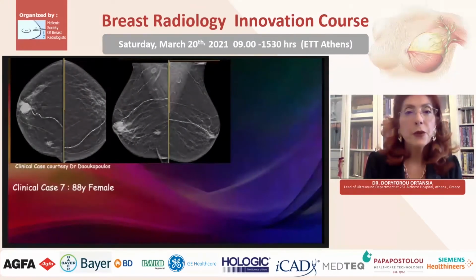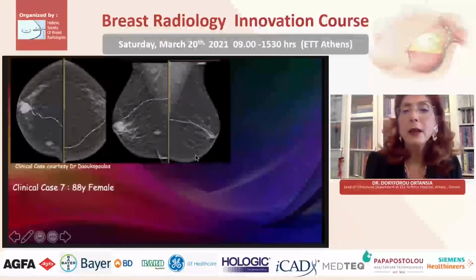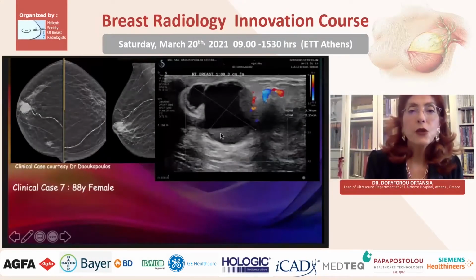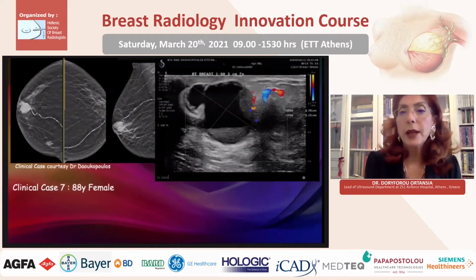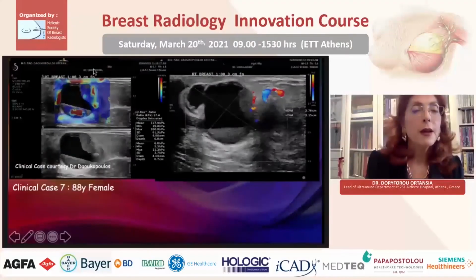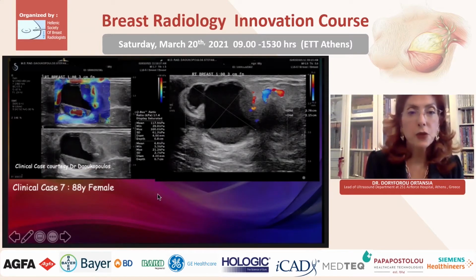Double assessment for this older lady. You see there are 2 lesions, one behind the nipple and one in the medial part of the breast. With regards to the lesion behind the nipple, this lesion could be a BI-RADS 2/3, could correspond to a complex cyst. But what happens with the shear wave? Perilesional stiffness, very suspicious.